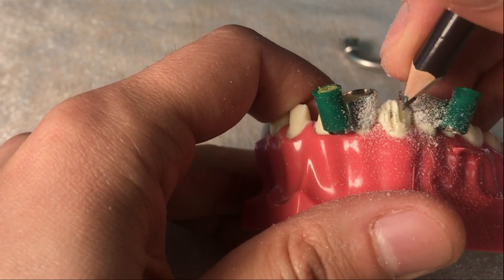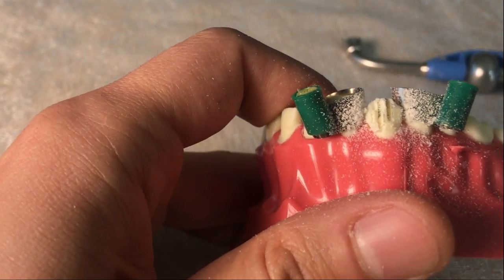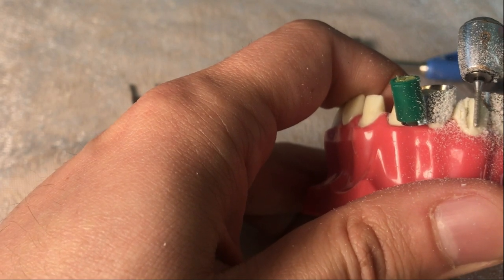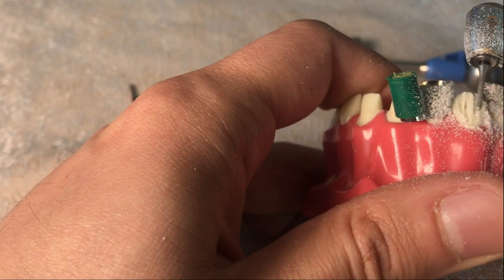I paint the deepest points of the grooves with a pencil. The purpose of doing this is not to lose the absolute preparation depth. If I lose the pencil stain completely, then it means I increased the depth involuntarily.